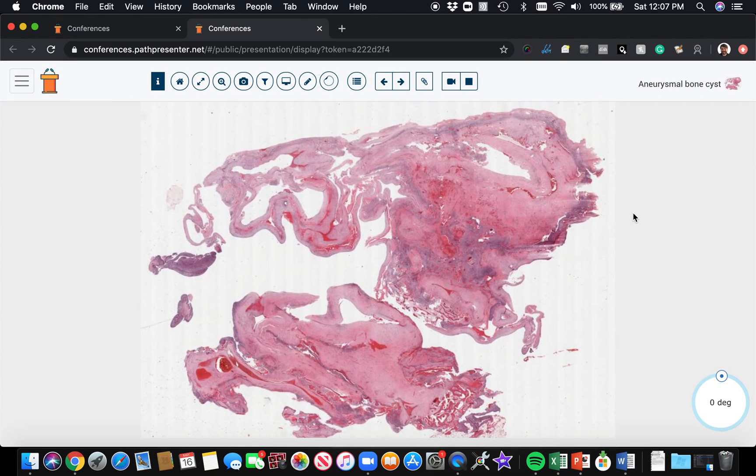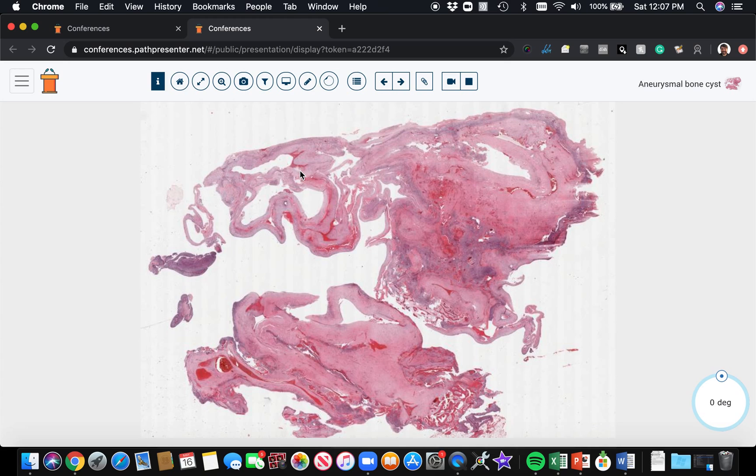Now let's go back to bone for a second. This is an example of aneurysmal bone cyst, and I wanted to talk about it here because surprisingly it seems like there may be some sort of relationship between aneurysmal bone cyst and nodular fasciitis.